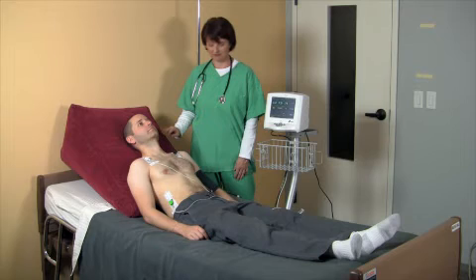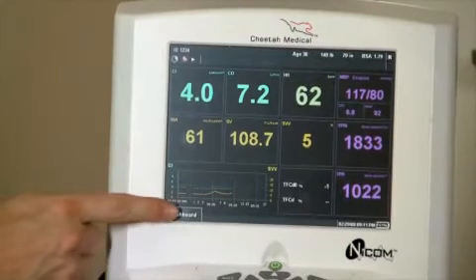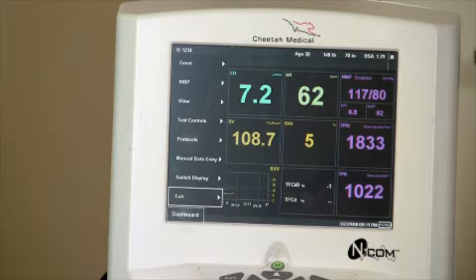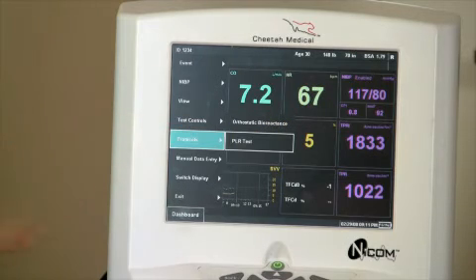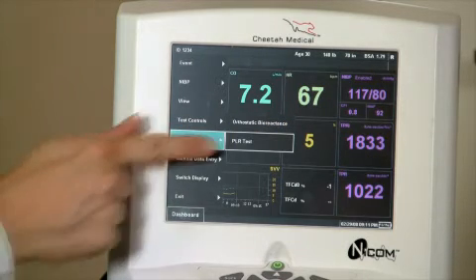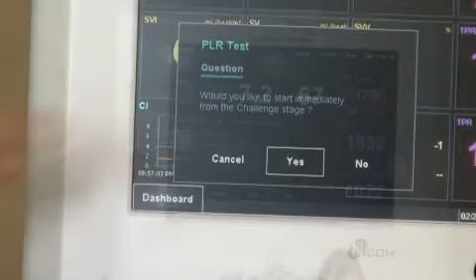Start the protocol by following these steps. First, press Dashboard, then select Protocol on the side menu. Next, select PLR Test.